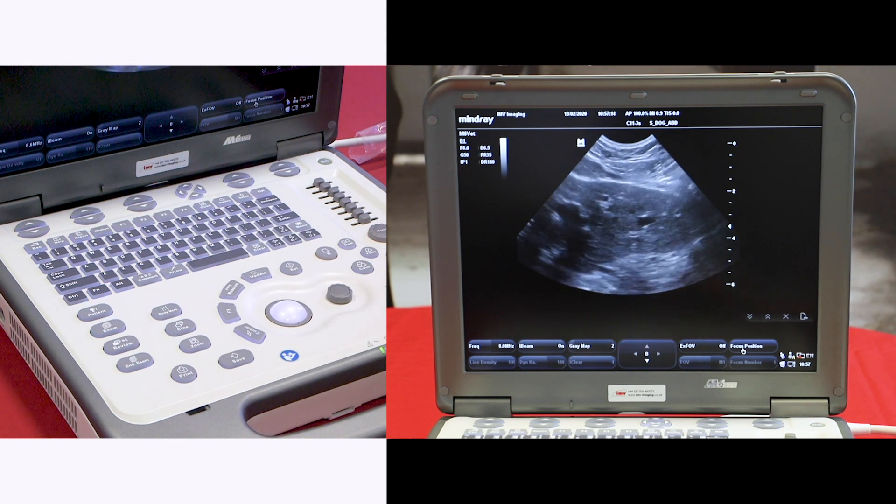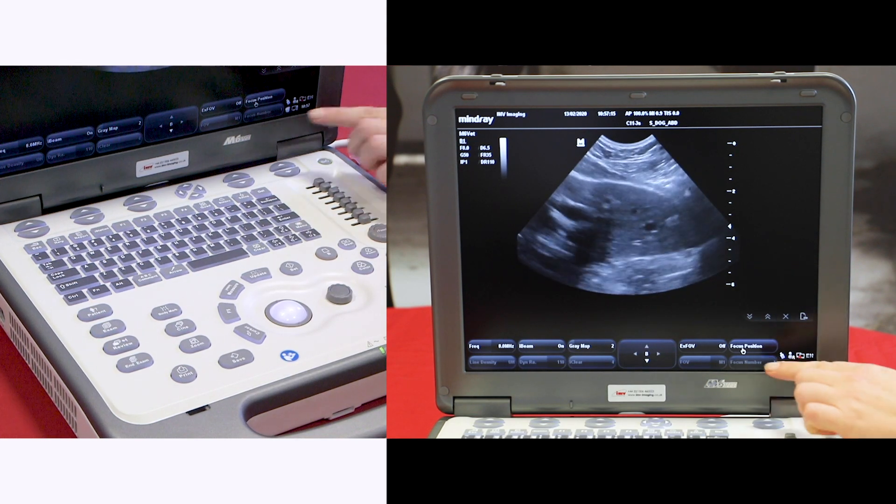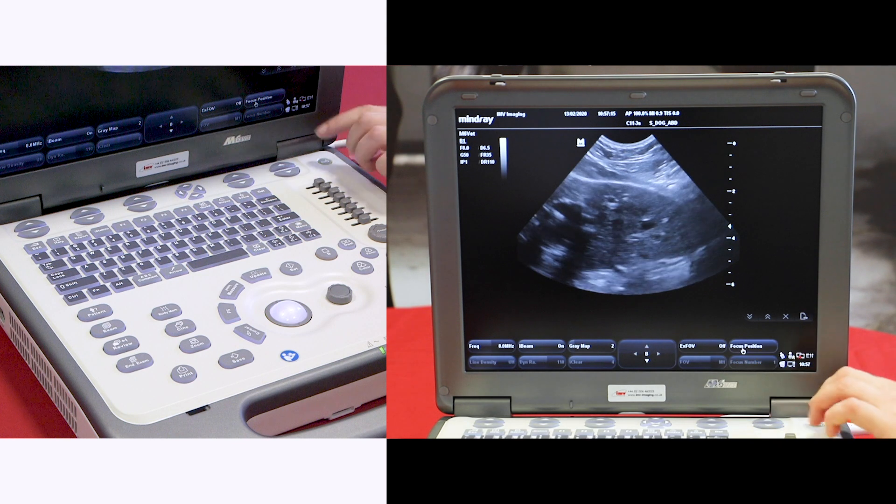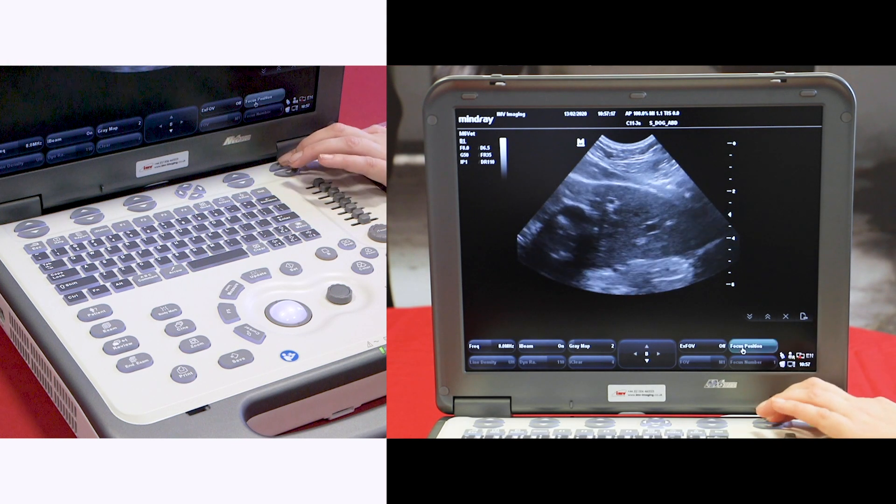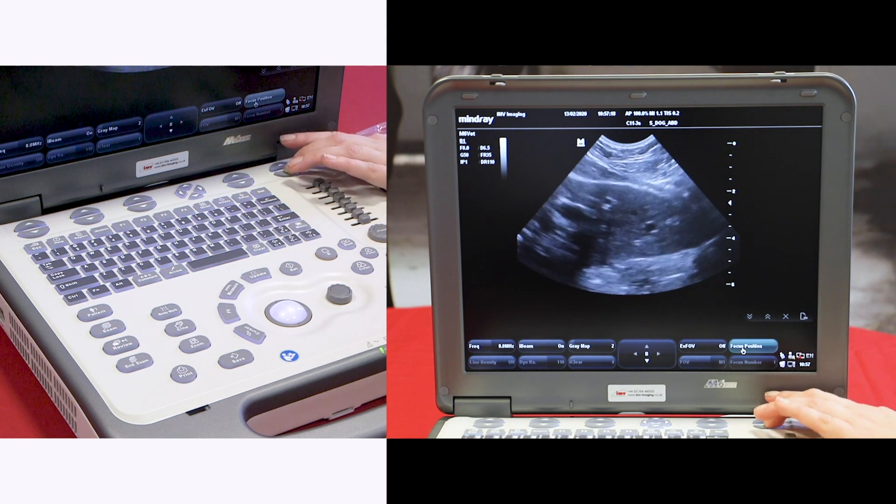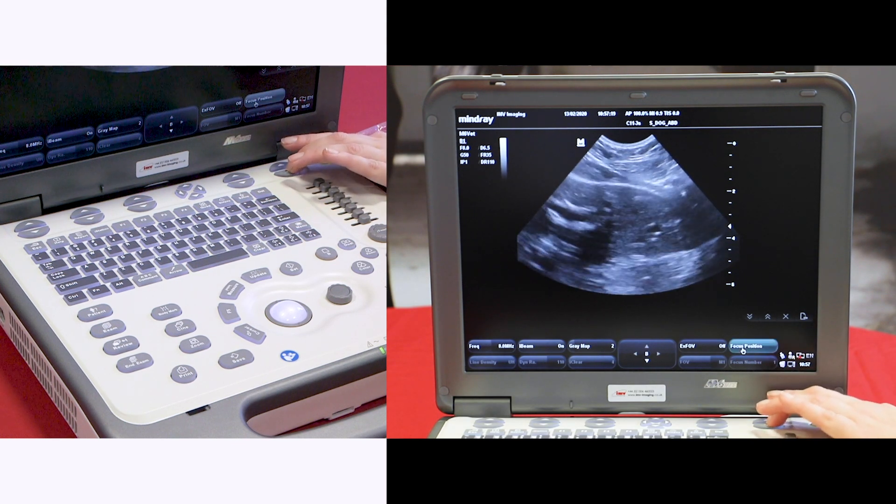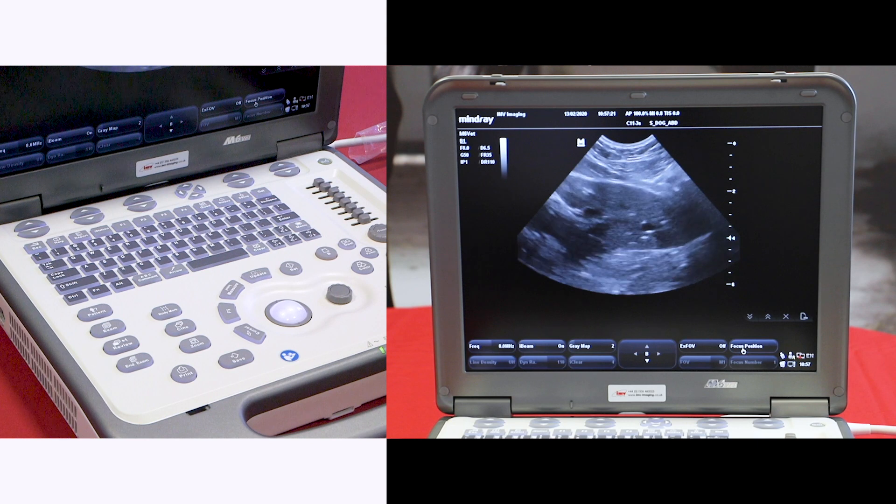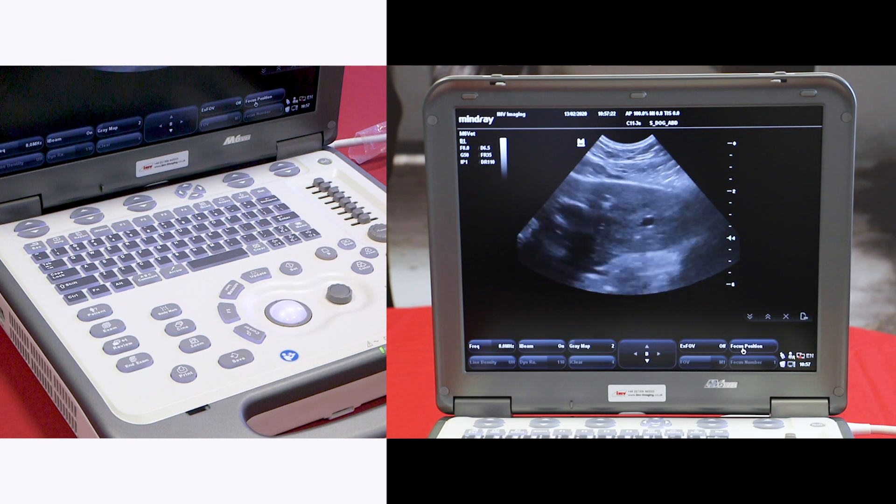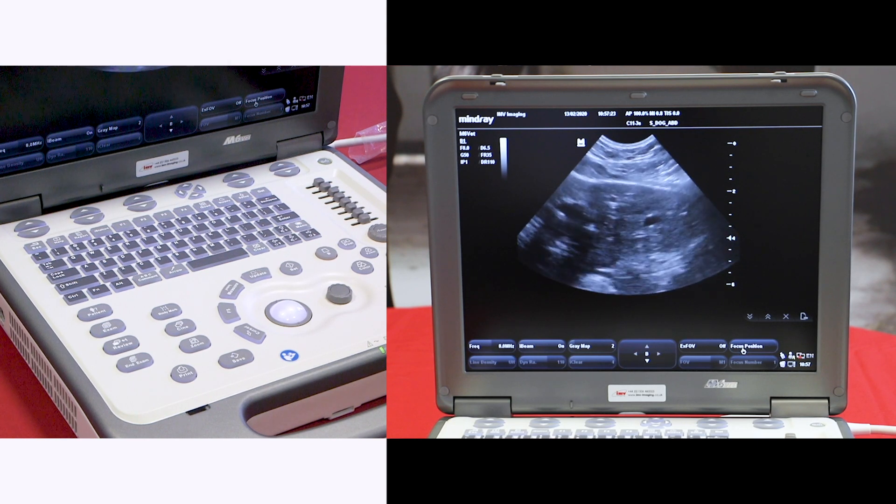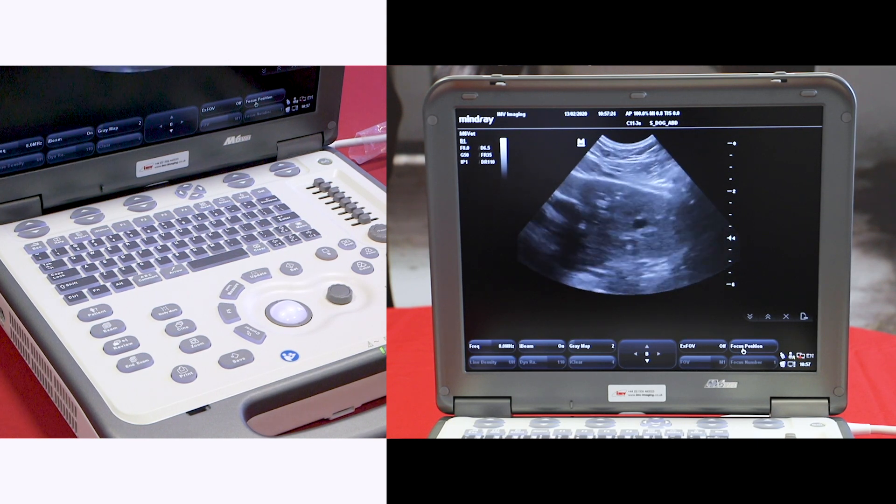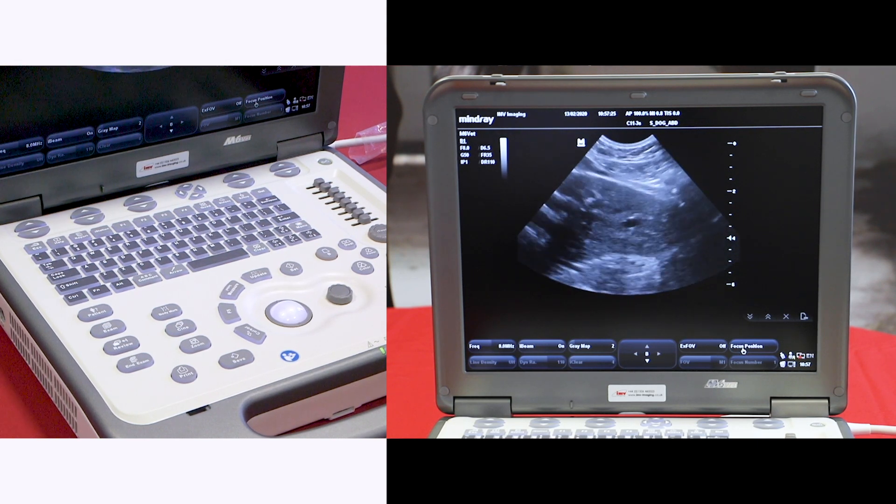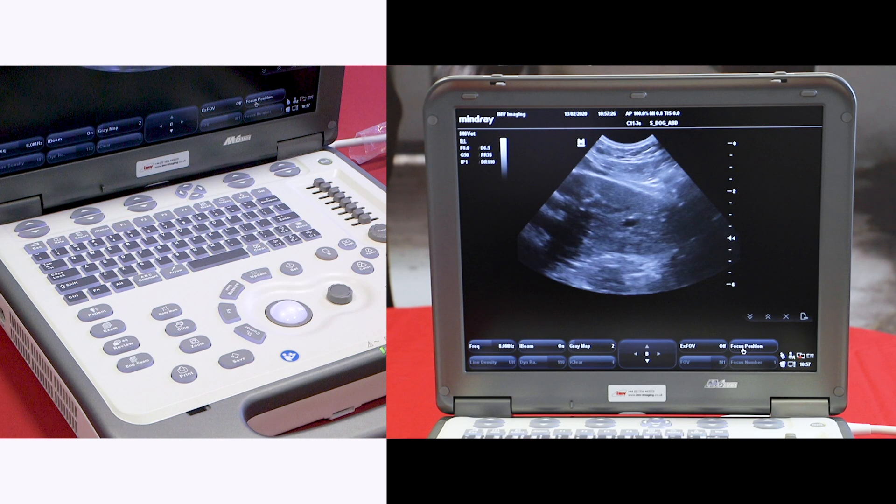The last thing is your focal position. The labels here and these buttons will change the position of your focal point. I always have my focal point level 2 or just deep to the organ of interest.